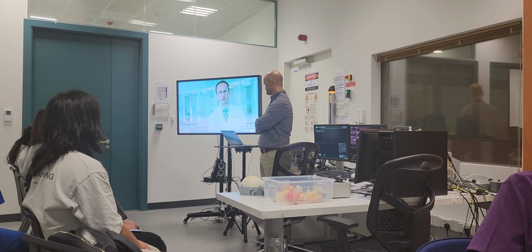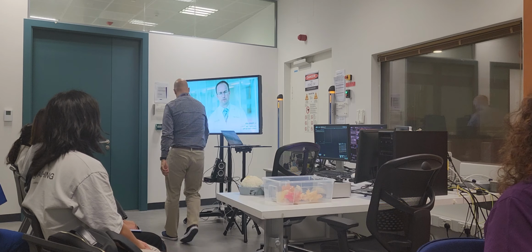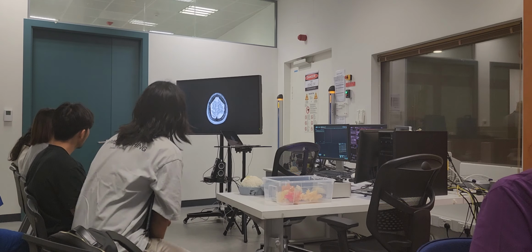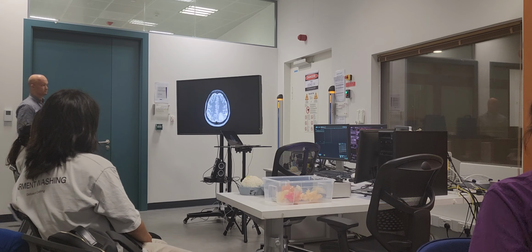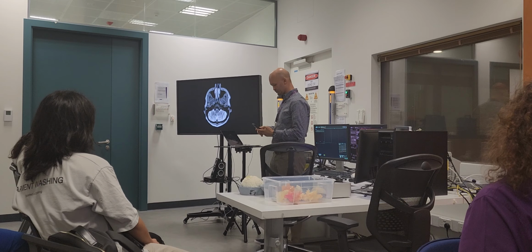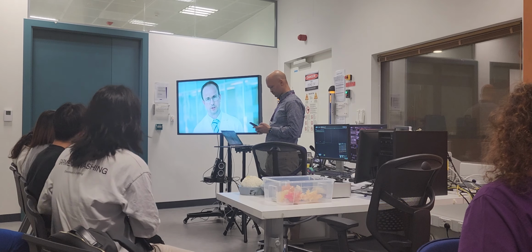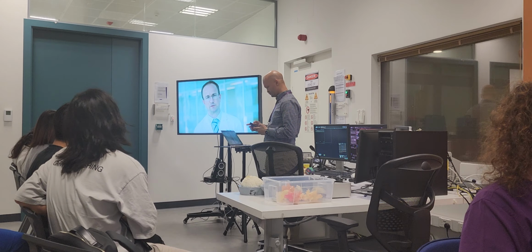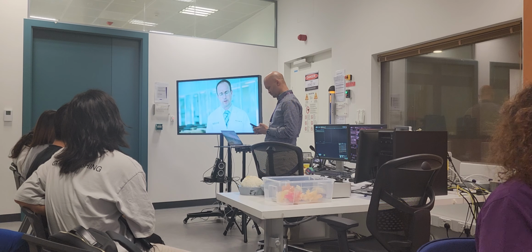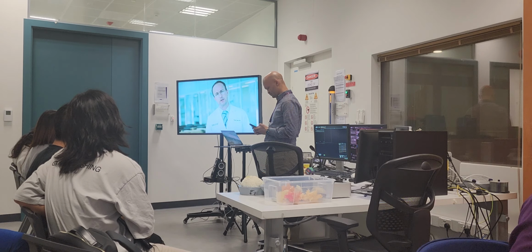Let's think about the brain surgery. Whenever we have a patient who has been diagnosed with a tumor or brain lesion, in very close proximity to an eloquent or very functional brain area, this enables us to perform microsurgical resection without compromising any functional disability in the patient afterwards. Even more, it requires a deep understanding of the language generation in humans.